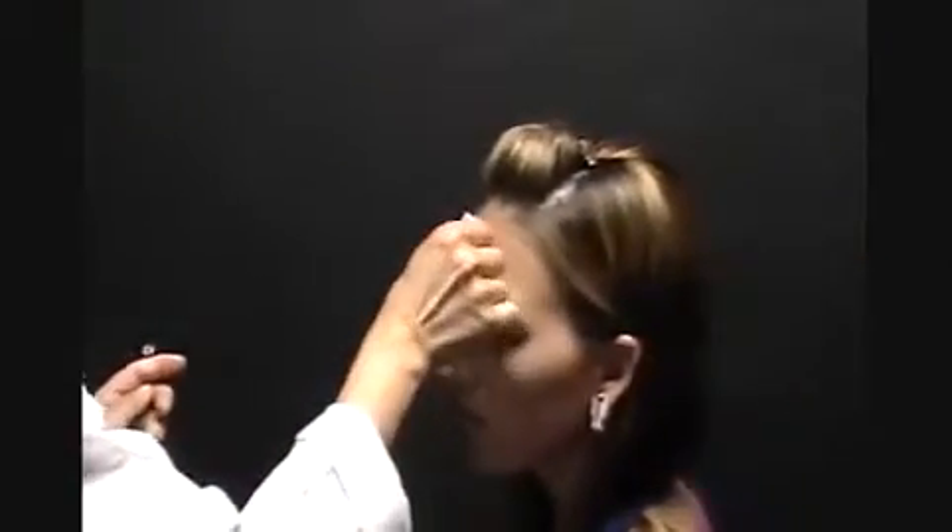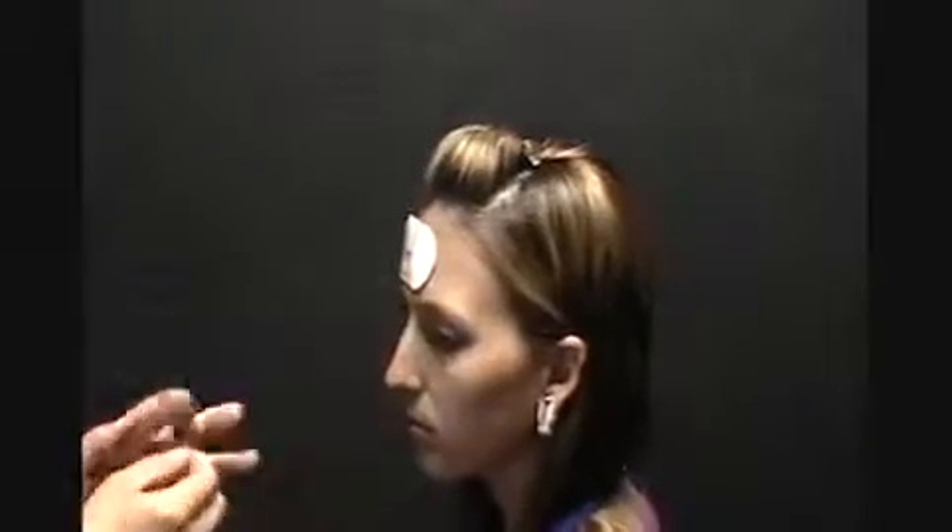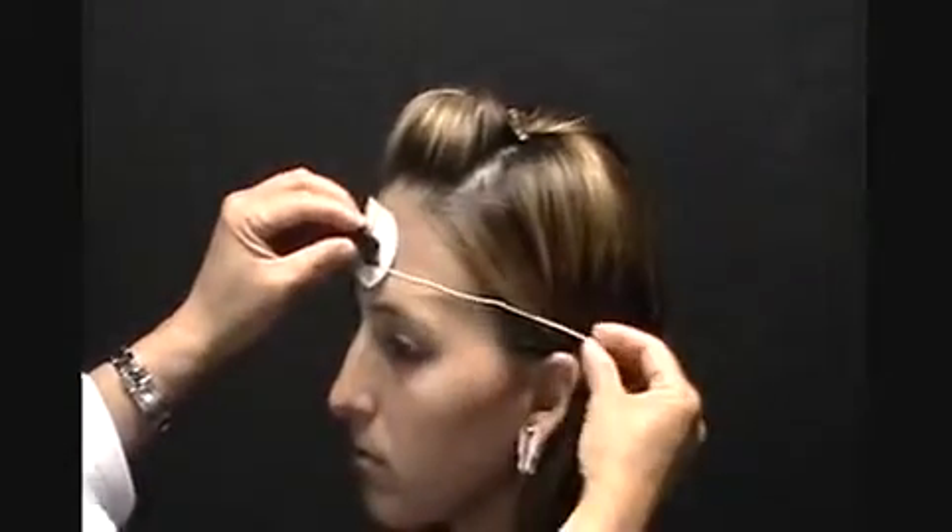The next one is a different electrode, which goes to the forehead. We're going to clean her forehead right here. Again, the same process — a tissue will abrade the skin. This is the same thing as an EKG electrode; it has the same metal clip for contact. We loop this around her ear for convenience.